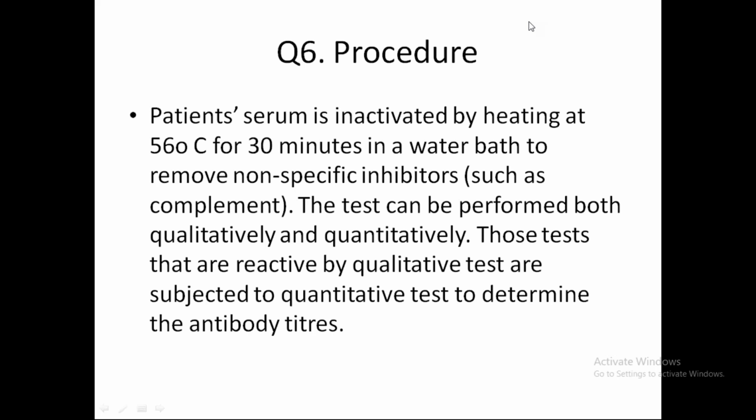Why do we need to inactivate the serum? We need to inactivate it to remove non-specific inhibitors such as complement factors. The test can be performed both qualitatively and quantitatively. Those tests that are reactive by qualitative are subjected to quantitative to determine the antibody titers.